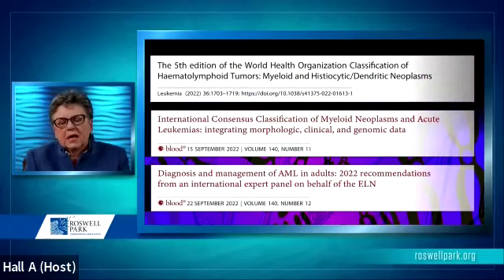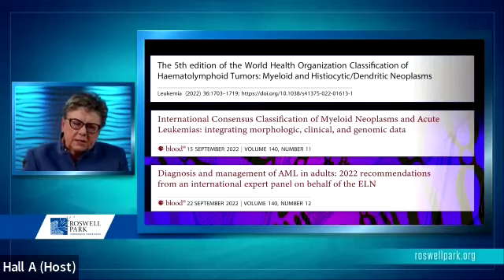Chromosome analysis has continued to be an important portion of classification of tumors as well as hematologic malignancies. Three recent papers on leukemia and blood have come out in the past couple of months, reanalyzing the classification of both myeloid as well as lymphoid malignancies, and they all continue to include chromosome analysis.